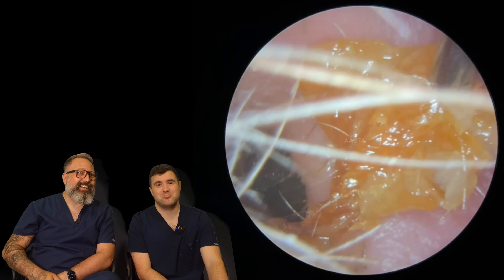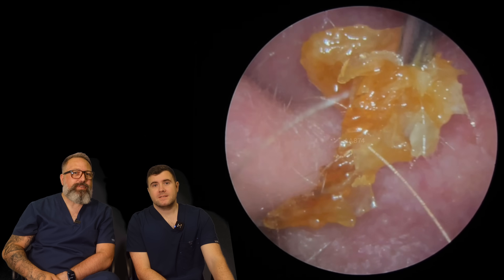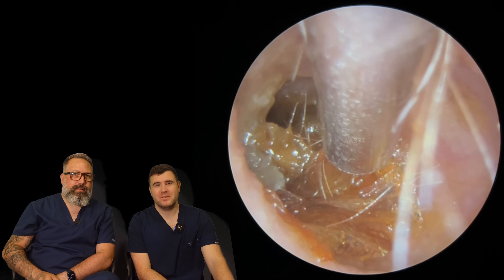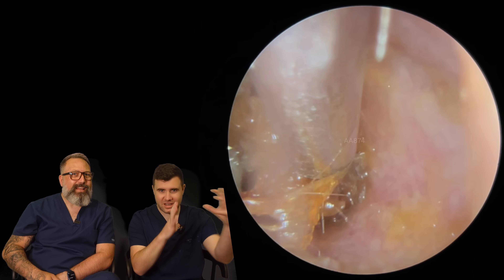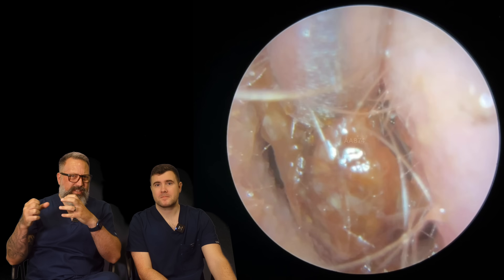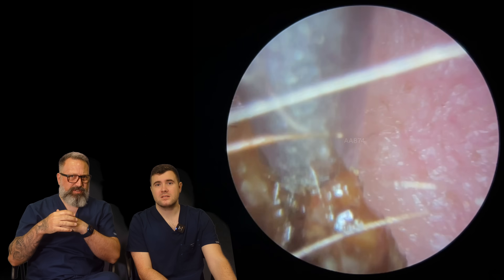Look at that keratin — that's thick. That's a chunky piece, chunky piece of keratin. That's a bit of a messy one, isn't it? It almost looks like it's all different consistencies. I thought this was going to be one big hard plug, but it's just totally different consistencies all the way through.